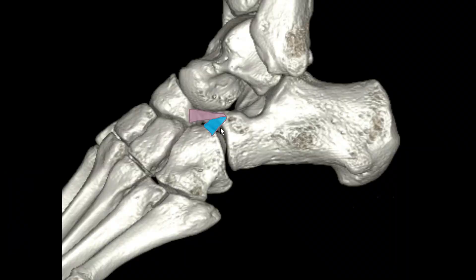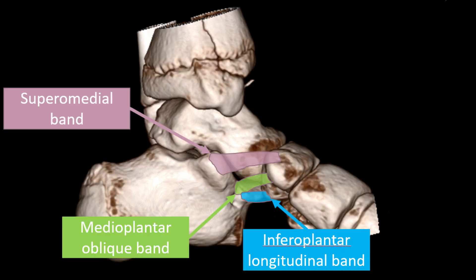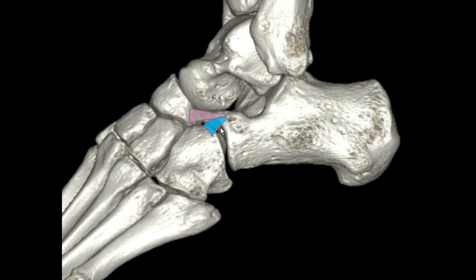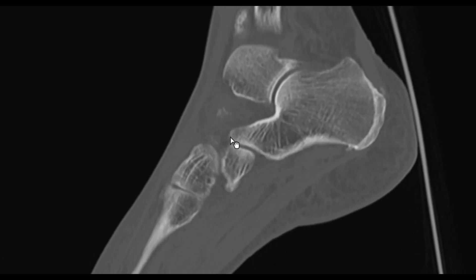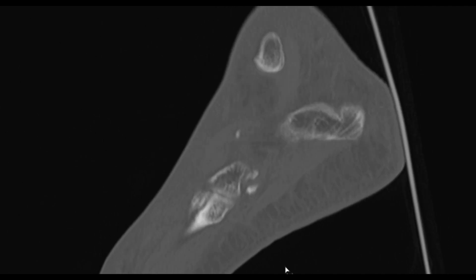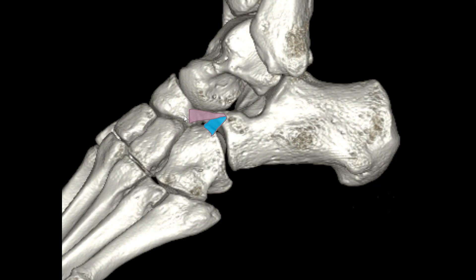The bifurcate ligament consists of two parts, both originating from the anterior process of the calcaneus — one running to the navicular bone and one to the cuboid bone. Like the plantar Lisfranc ligament, it is y-shaped. Be mindful that this is not the spring ligament, as we are on the lateral side of the foot. Avulsion injuries of the bifurcate ligament are frequently seen with isolated fractures of the anterolateral process of the calcaneus.